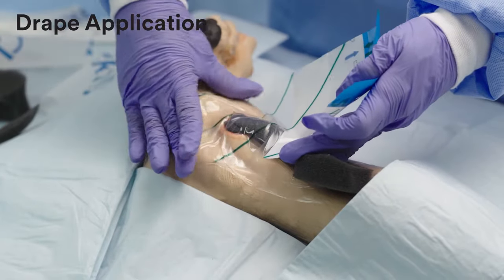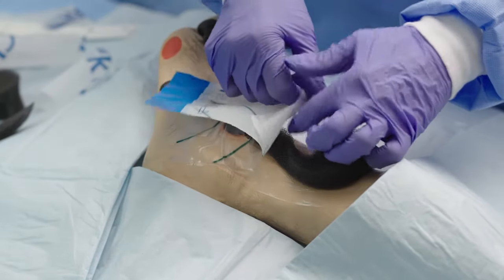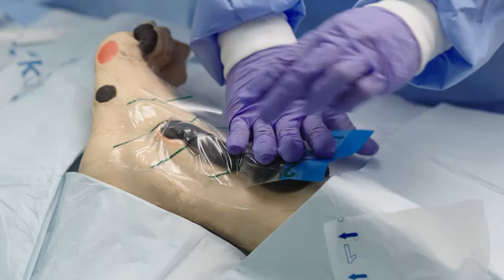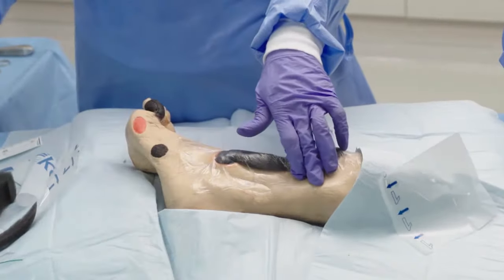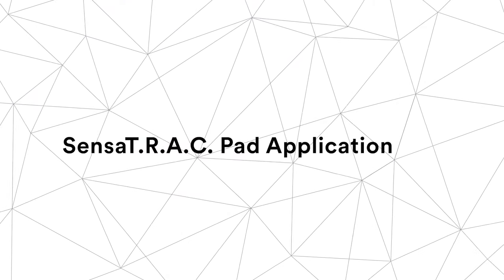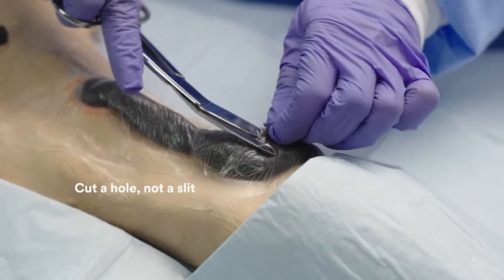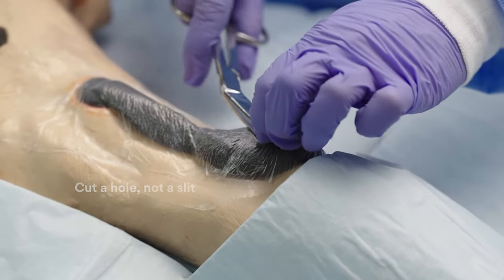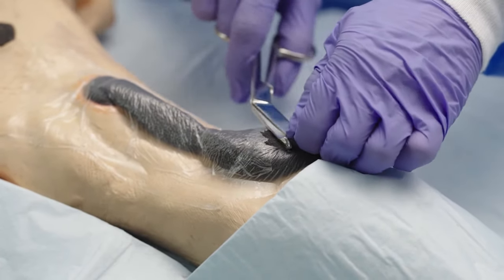Apply the drape over the foam, extending it to cover both the wound and the elongated foam to obtain a seal. Pinch the VAC Drape and carefully cut an approximately 2.5cm hole, not a slit, through the VAC Drape. The hole should be large enough to allow for removal of fluid and exudate. You do not need to cut into the foam.